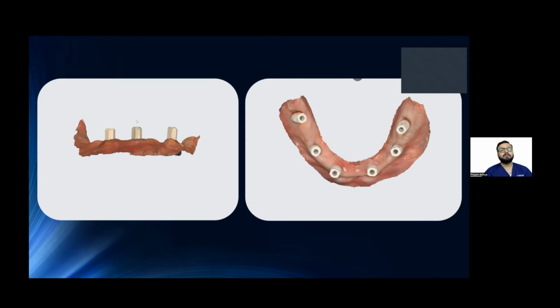Of course, there are numerous apps to support you, and I'm in love with those apps. Especially the Model Builder app is, I believe, one of the best apps that any software has. And apart from that, the occlusal analyzer is also very accurate. You can use the auto simulations, the smile designer, and there are numerous features. That's not my job to talk about today. So make the best of your Medit Link. Don't just see it as a scanner, see it as an entire ecosystem, and make the best of your ecosystem.